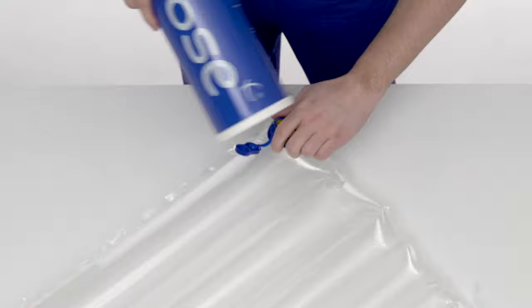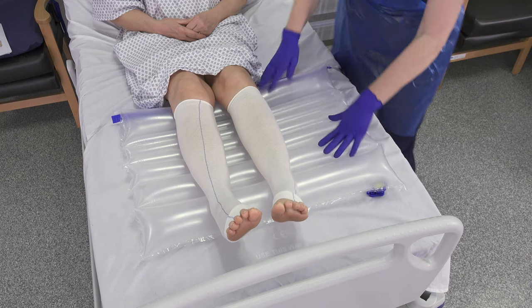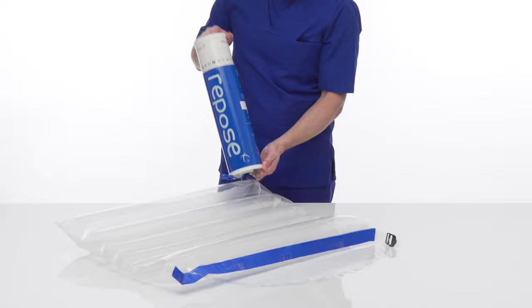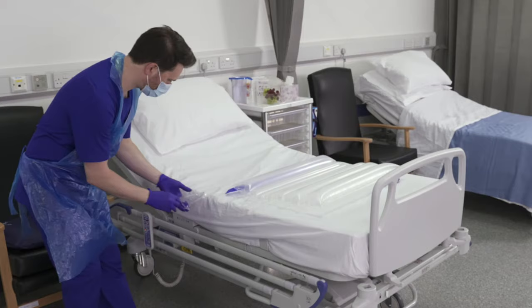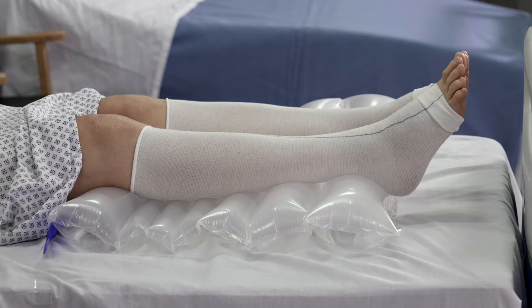Disconnect the pump and cover the valve with the solid end of the Repose sealing cap. Check Repose regularly and top up within a period of no longer than 14 days using the pump supplied. Install Repose with the valve facing down and away from the patient, and secure in place with the integrated retaining strap.